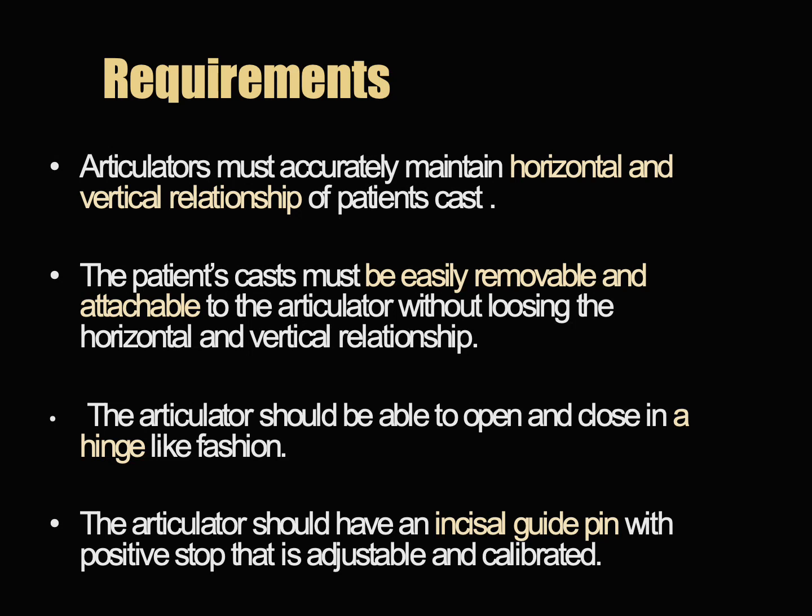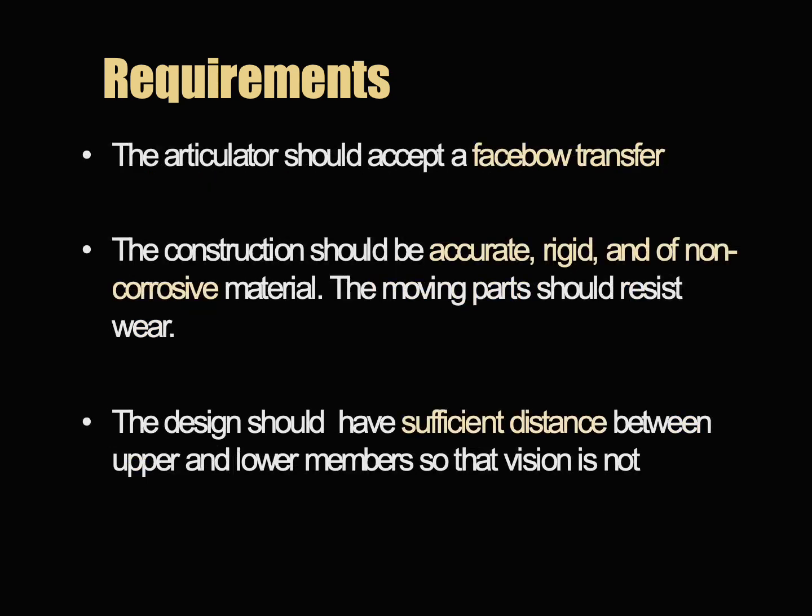The articulator should have an incisal guide pin with positive stop that is calibrated and adjustable. The articulator should accept a face bow transfer. It should be accurate, rigid and should be made of non-corrosive material. The moving parts should resist wear. The design should have sufficient distance between the upper and the lower members so that vision is not hindered.